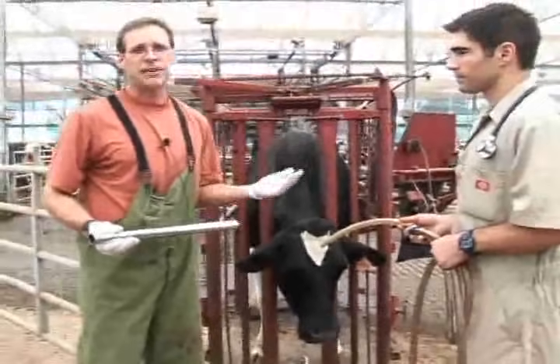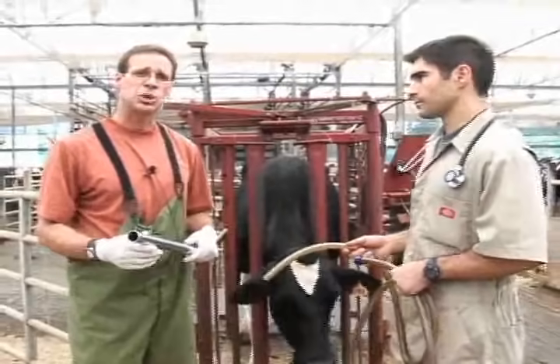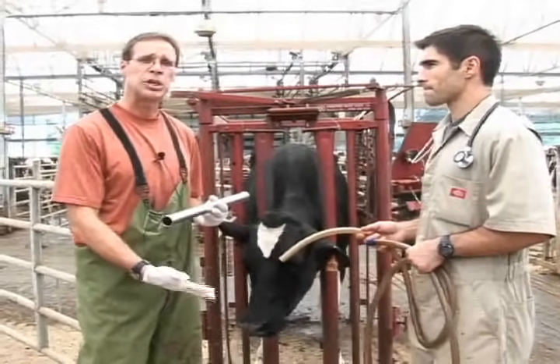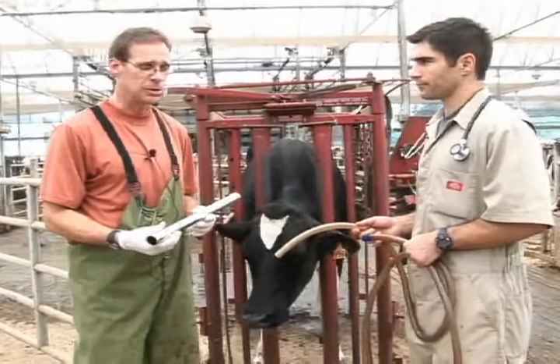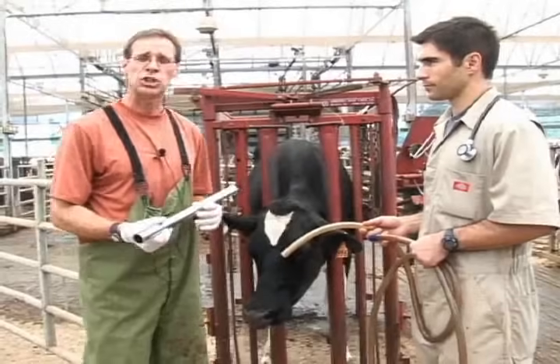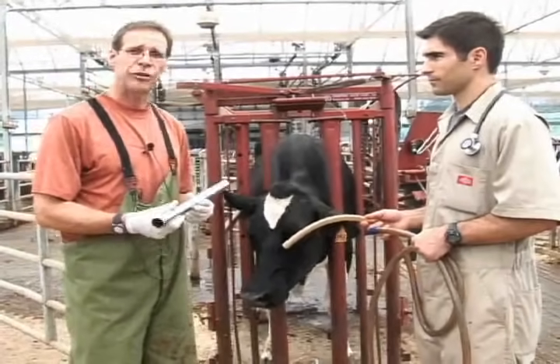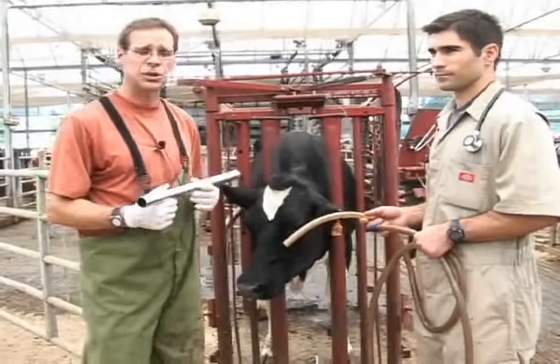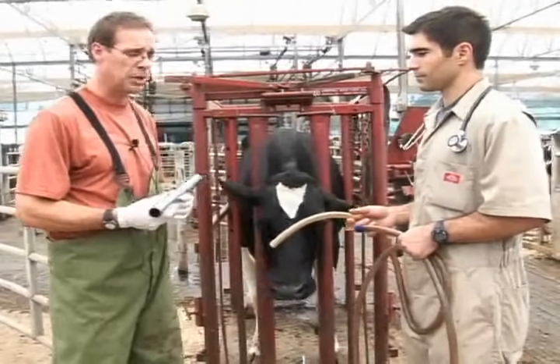This is a very serious procedure because one major complication is actually administering a large volume of fluids into the lungs instead of the stomach. So we want to make sure that we're not in the lungs, and there are many different checkpoints along the way when securing this tube down the esophagus and into the rumen that we must observe.